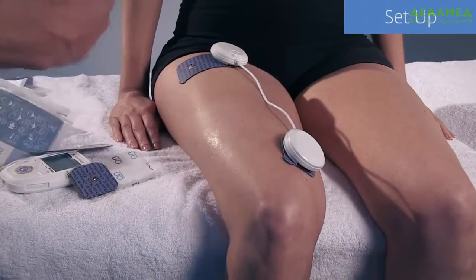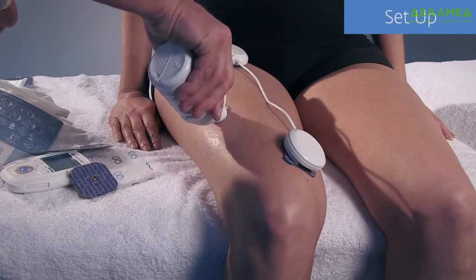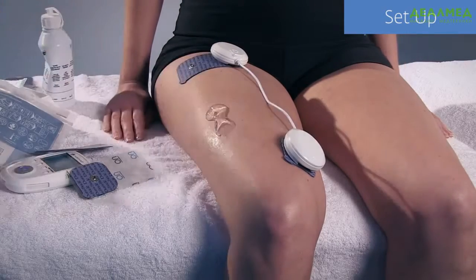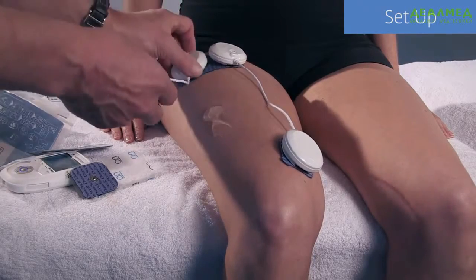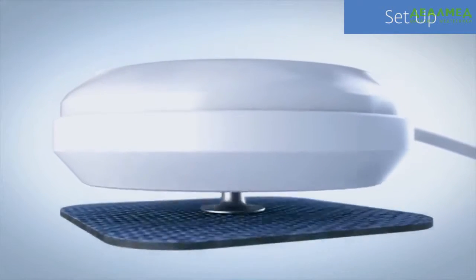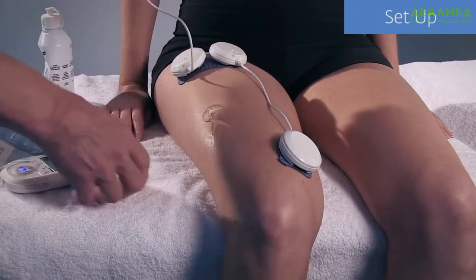To optimize treatment, it is desirable to place the electrodes correctly. One electrode, large or small, depending on the size of a muscle group being treated, is placed away from the muscle belly. It is referred to as a reference electrode. A second electrode is then placed over the muscle's motor point.